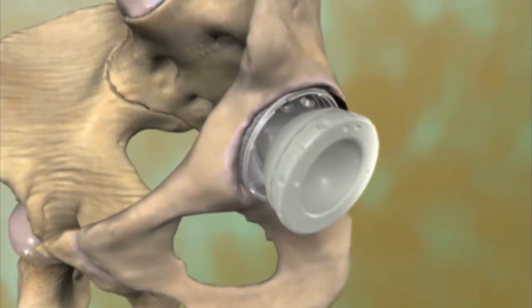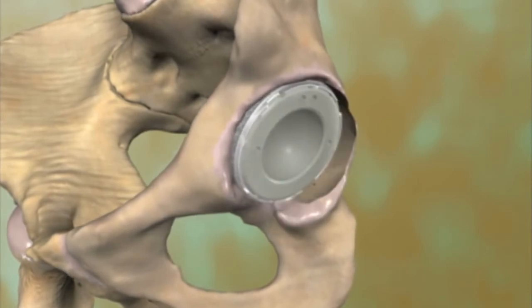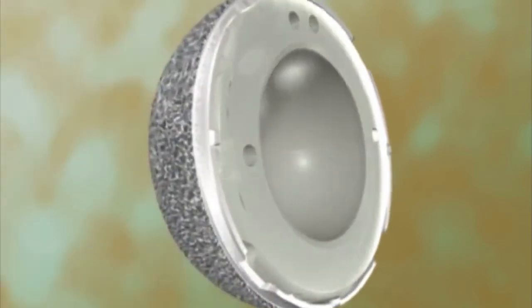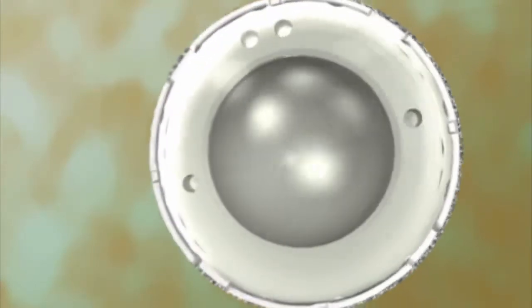The inner plastic portion has a hollow to hold the replacement for the ball-shaped bone at the top of the thigh bone, or femur. The outer metal part is rough to help bone grow into its surface over time to lock the artificial socket in place.